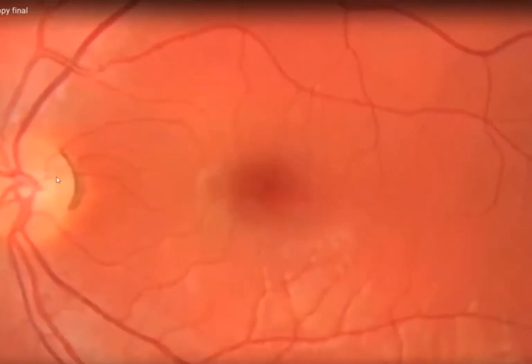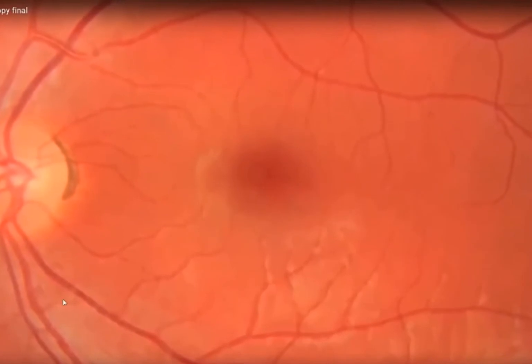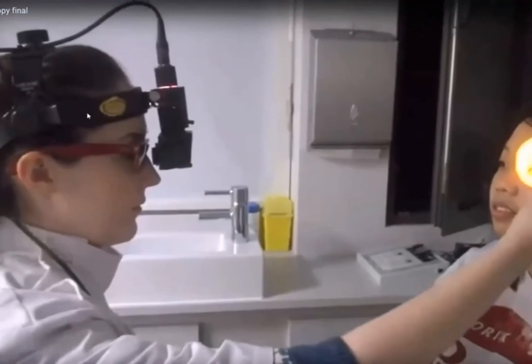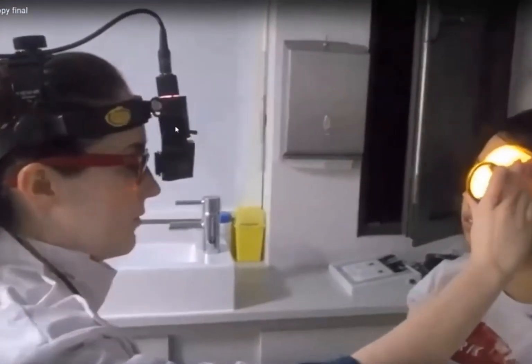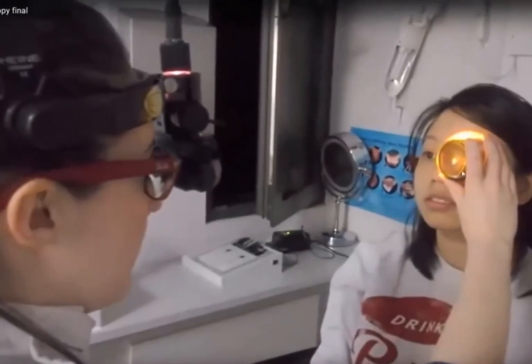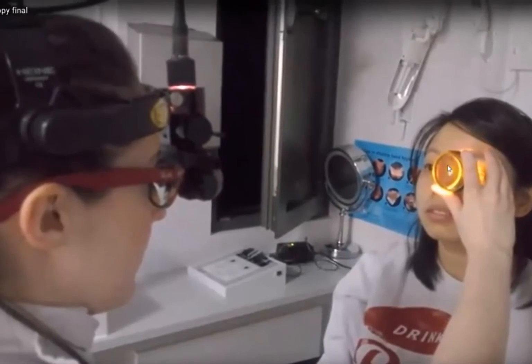So this is what they are observing, right? The back of the eye. Basically, the surgeon has to put up binoculars here and apply the magnification lens and shoot back.